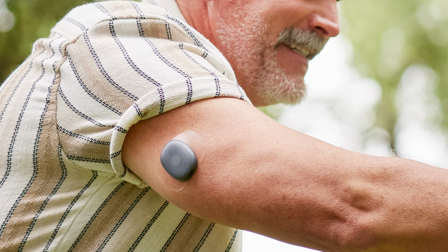Okay. So there's no change in size to the sensor. Has the transmitter, the piece that's worn on the outside in order to capture these measurements, has there been any change in the size or shape of that, or the internals? There certainly have been changes to the internals. We've been working on things. One of the things, of course, is you're always fighting. You want a whole bunch of battery capacity, right? So it lasts longer, but you also want to take the size down, right? So the smallest on-body that you can. We've certainly been working on that.